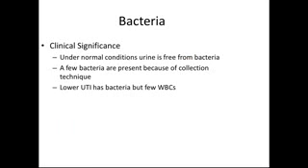Bacteria, clinical significance. Under normal conditions, urine is free from bacteria. Sometimes there can be a few bacteria present because of the collection technique if there was contamination. A lower urinary tract infection has bacteria but with few white blood cells. An upper urinary tract infection has bacteria with many white blood cells.